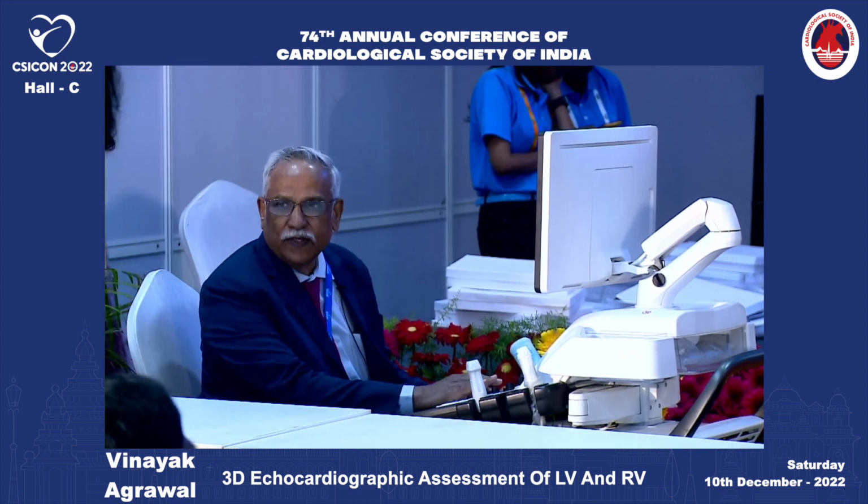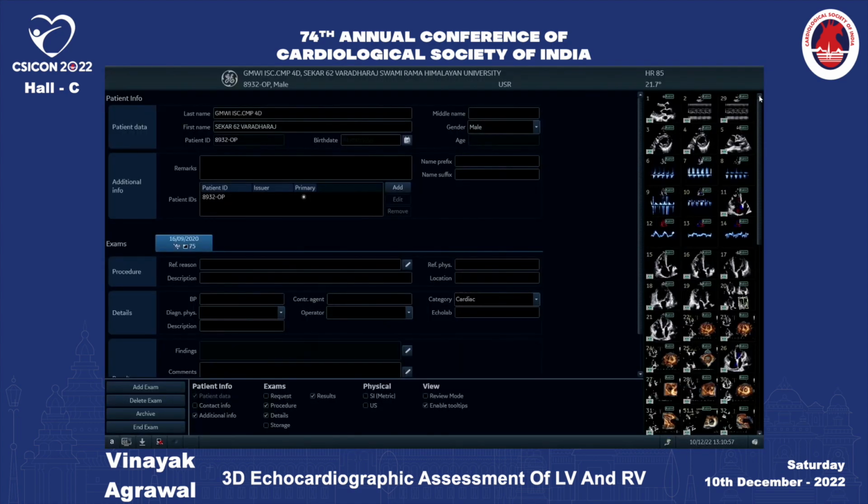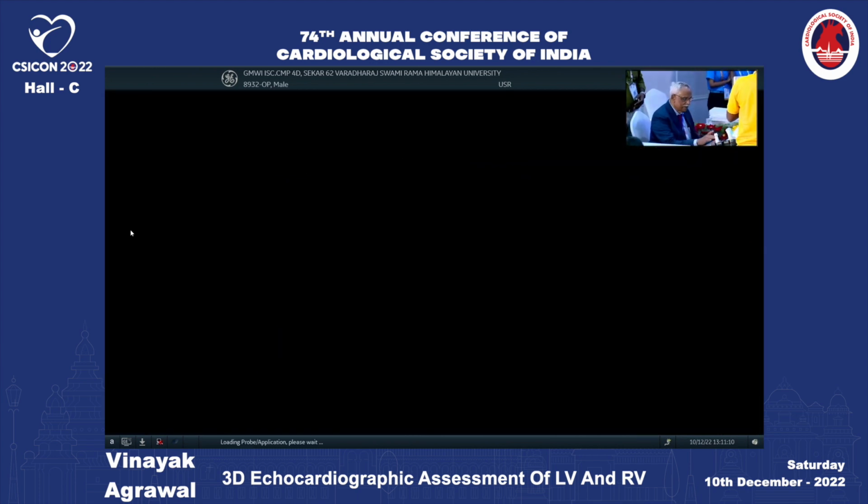So one of the important questions which is often asked in echocardiography is how is the LV function, or in particular, what is the ejection fraction? That is one of the questions which is often asked.